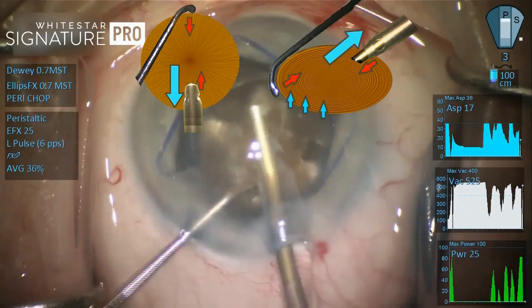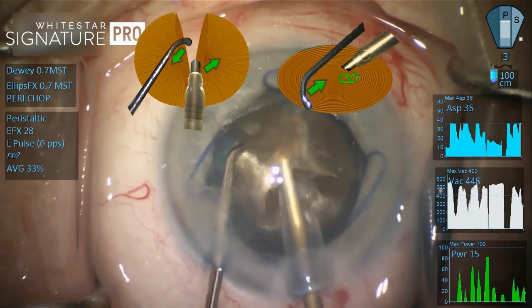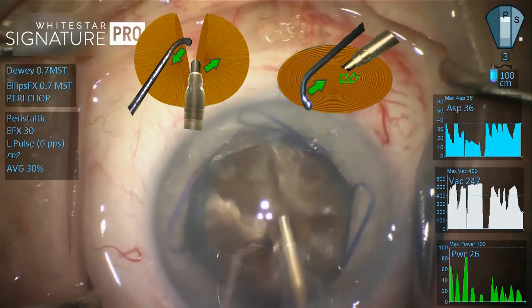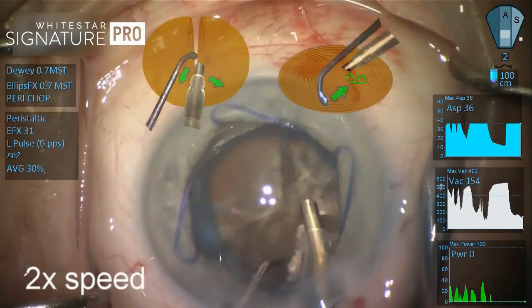So again, the chop is performing very well, but it's got a leathery posterior plate. So I've initiated my chop just like I know I should. I've wrapped the two instruments, I pulled them together, and as you separate them though, however, those posterior fibers are just so tough and so leathery, they really don't split, even with the initial posterior manipulation you might attempt.